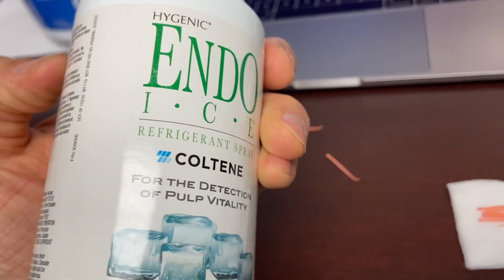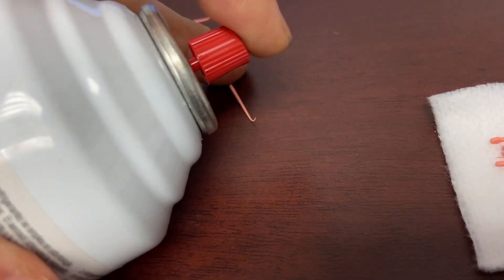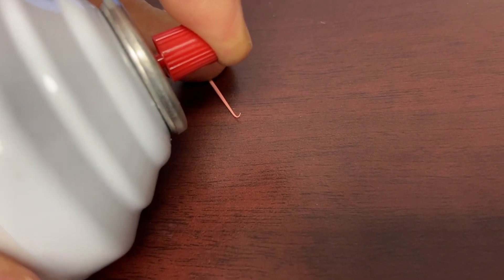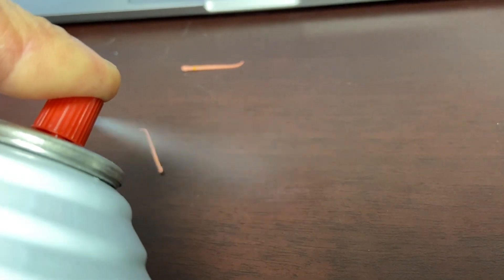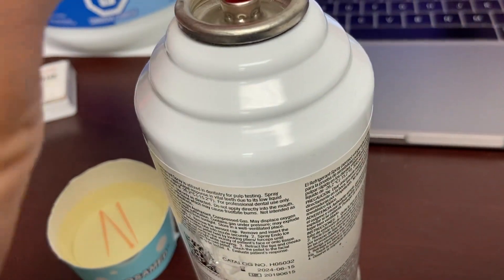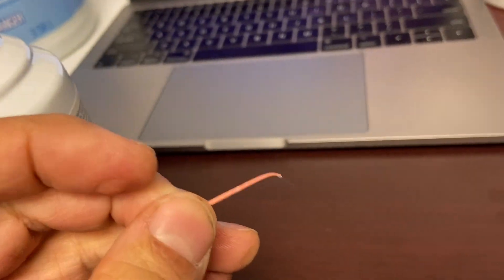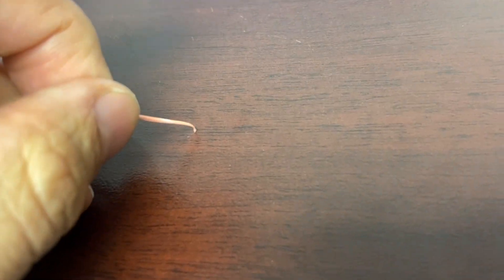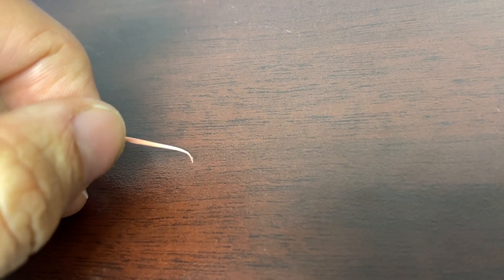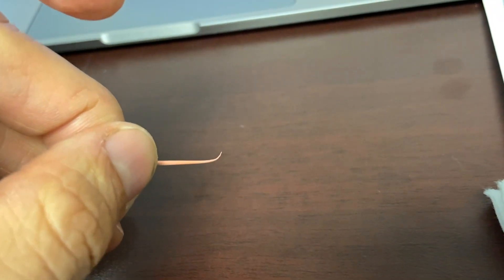Another purpose for endo ice — this is not flammable, I've tried to burn it to make a viral video, it won't work. But what you can do is spray it on the gutta percha, and it becomes almost resistant to bending. So you've got like 30 seconds to get that gutta percha down and around in that beautiful curved canal. And then you've got confidence.